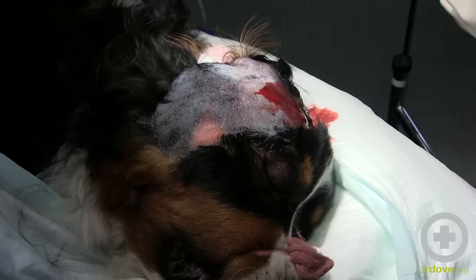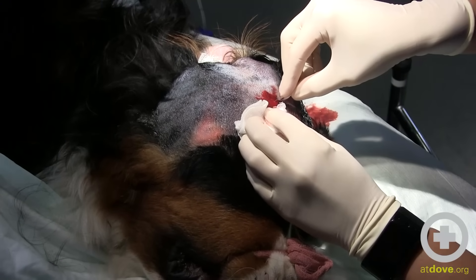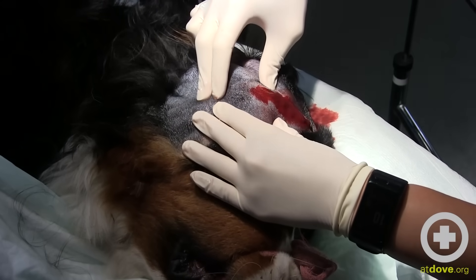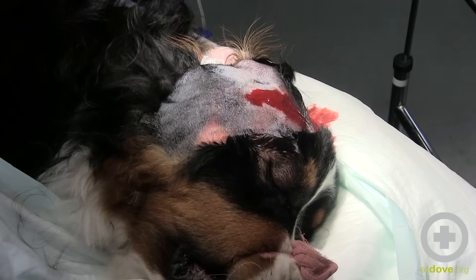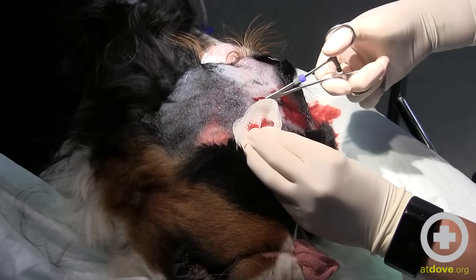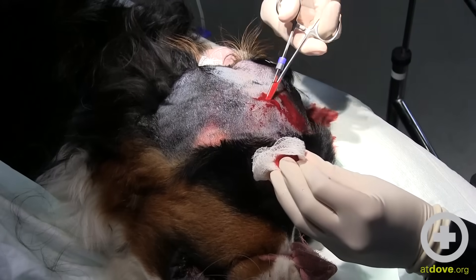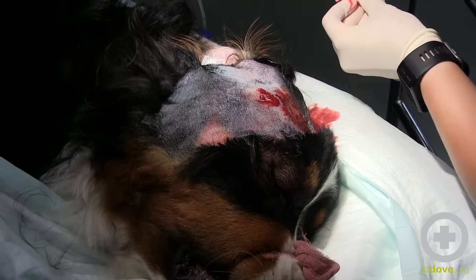I'm going to try to open this a bit further. The owner knew something was really wrong when the dog didn't want to eat this morning — and I don't blame her. I want to figure out where the biggest pocket goes before I make more of an incision. There's going to be a lot of fibrous, fibrinous tissue that might need to be broken down. It actually goes in every direction, so we'll just make our incision a little bigger over that area.